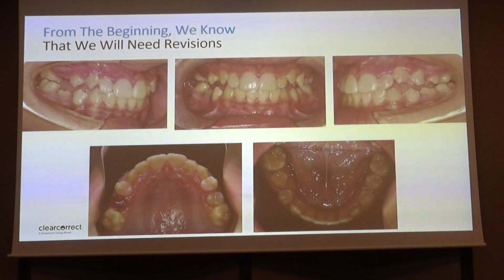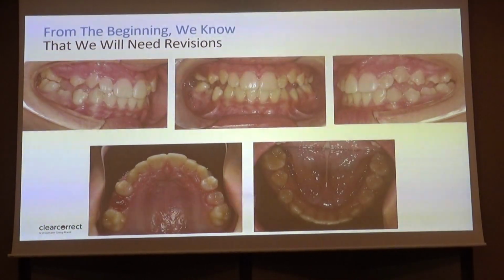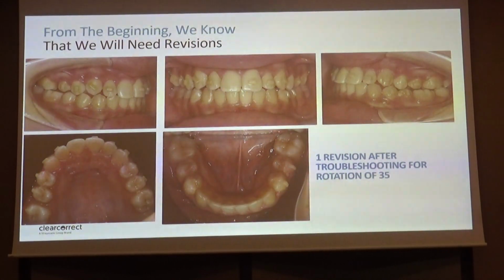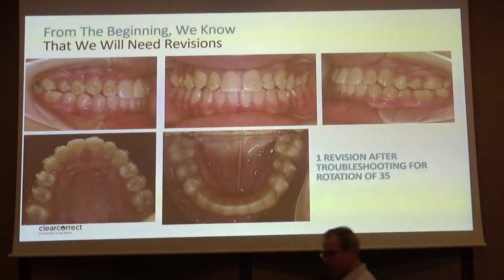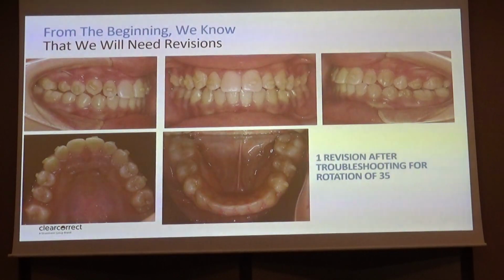Another case of management of the eruption of the teeth. So mixed dentition, and we are managing space. Very, very predictable, I would say very well indicated for this case that we need to manage the space. Do a little bit of expansion, gain space or close space, take advantage of the leeway space.